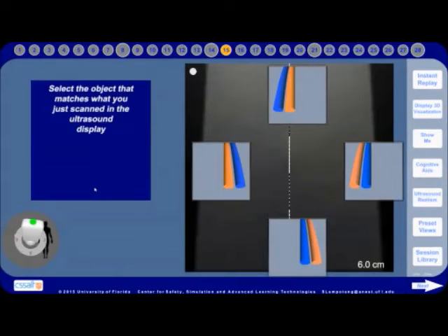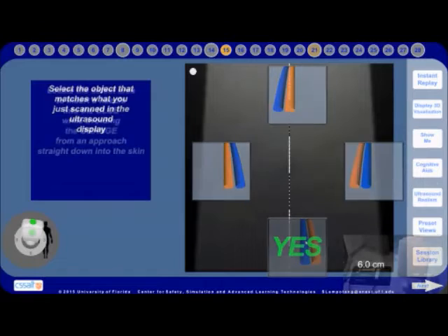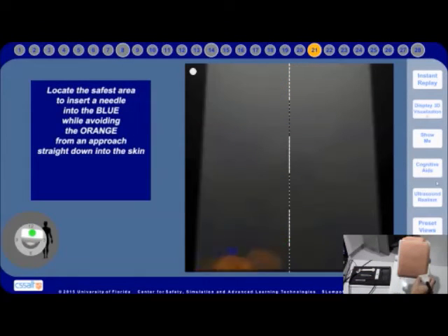Here, the user is holding the probe with the notch in the 3 o'clock position. Other tasks include tracing structures as they wind around other similar structures and planning out the safest needling areas.